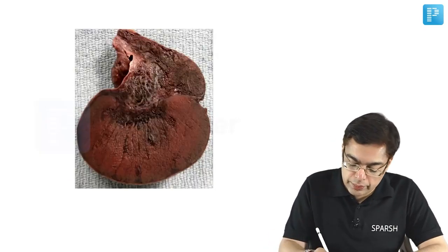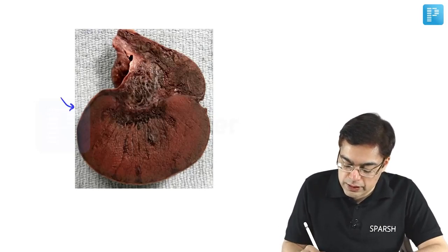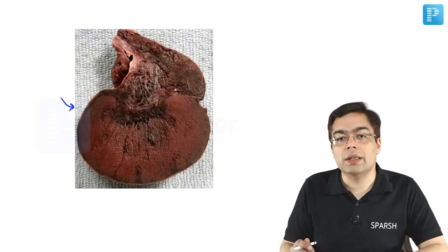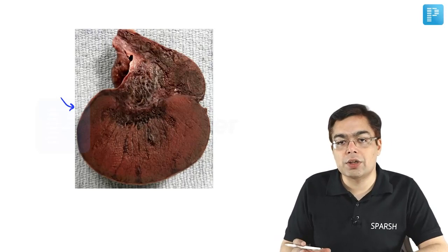Looking at the next important image, which is going to be a very important and a commonly observed presentation so far as the emergency is concerned, in which a young individual most likely is going to be having a presentation in the form of severe pain in the testicular area.